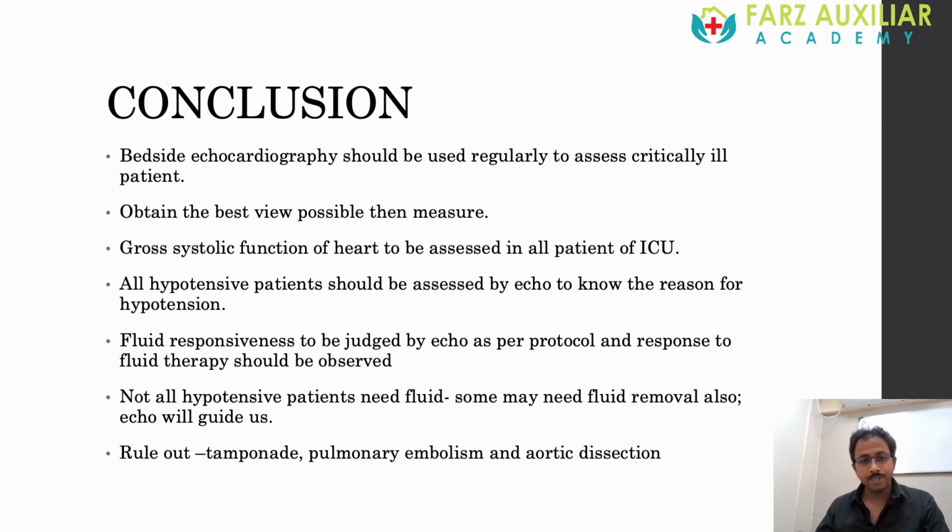All hypotensive patients should be assessed by echo to know the reason for hypotension. Fluid responsiveness is to be judged by echo as per the protocol, but more important, response to fluid therapy should be observed. Not all hypotensive patients need fluid. Some may need fluid removal also. Echo will guide us, and we have to rule out the 3 dangerous things, whether the patient is having any cardiac tamponade, pulmonary embolism or aortic dissection or not. Thank you.